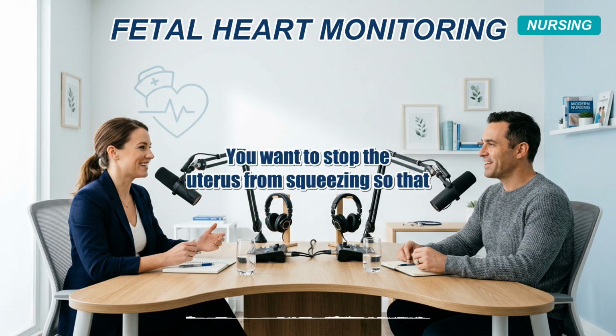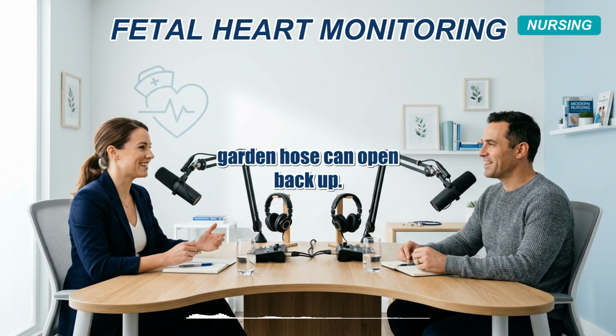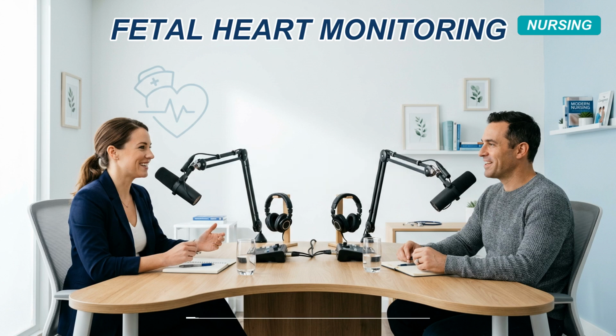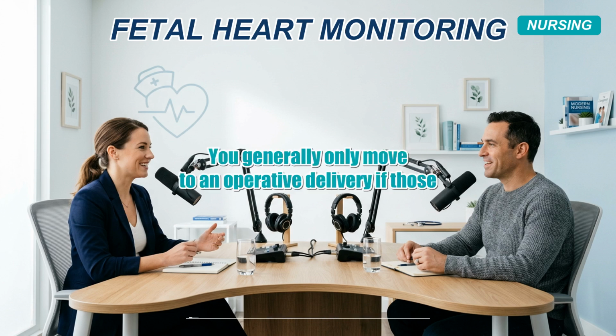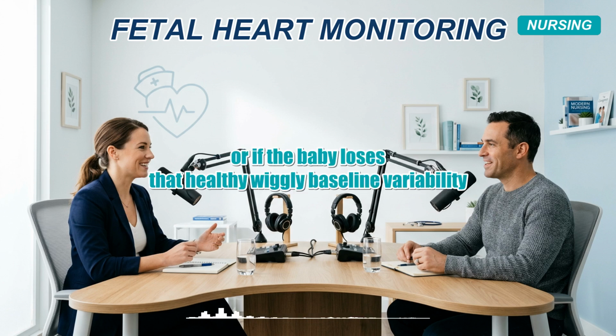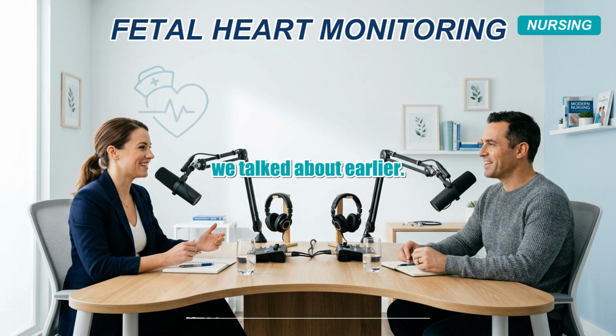You want to stop the uterus from squeezing so the garden hose can open back up. Exactly. You are attempting to restore placental blood flow. You generally only move to an operative delivery if those patterns don't resolve despite all those interventions, or if the baby loses that healthy, wiggly baseline variability we talked about earlier.